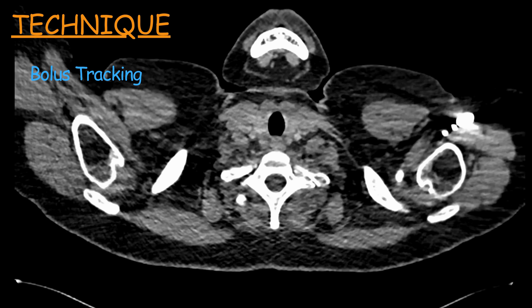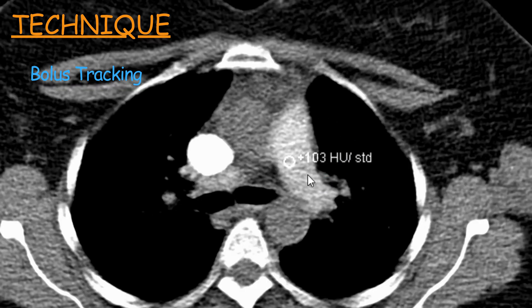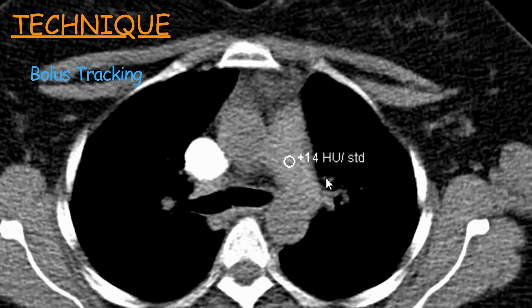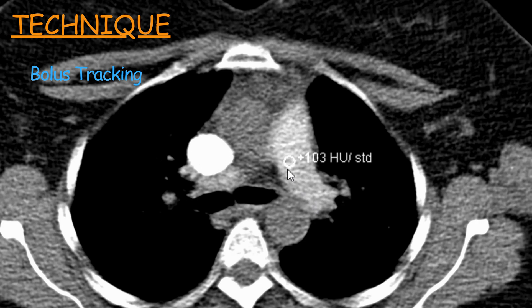In our center we generally use bolus tracking to perform CT pulmonary angiogram. In this method, a region of interest, also called ROI, is placed in the main pulmonary trunk, and then sequential axial images are acquired at this level until the contrast density — the Hounsfield unit in this area — reaches the desired level, which then auto-triggers the scan. You can see an ROI has been placed and multiple axial images acquired until the desired density is reached, at which point the scan starts on its own.